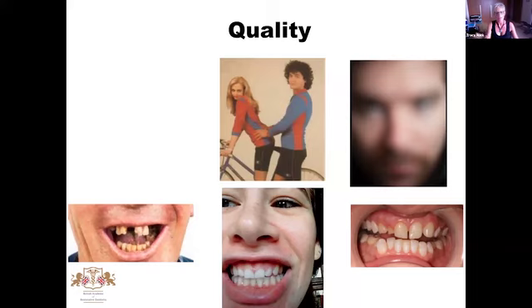And here we have two close-up shots that dentists often like, okay? So we always, dentists love retracted shots and close-up photos like this of teeth. But patients actually don't buy into the smile in this way when we present an image case with a retracted shot. If you think about it yourself, if you were going to buy a new jacket, you would want to see how your head looks as well as, you know, your lower part and your legs. You don't just want to see the jacket area, okay?